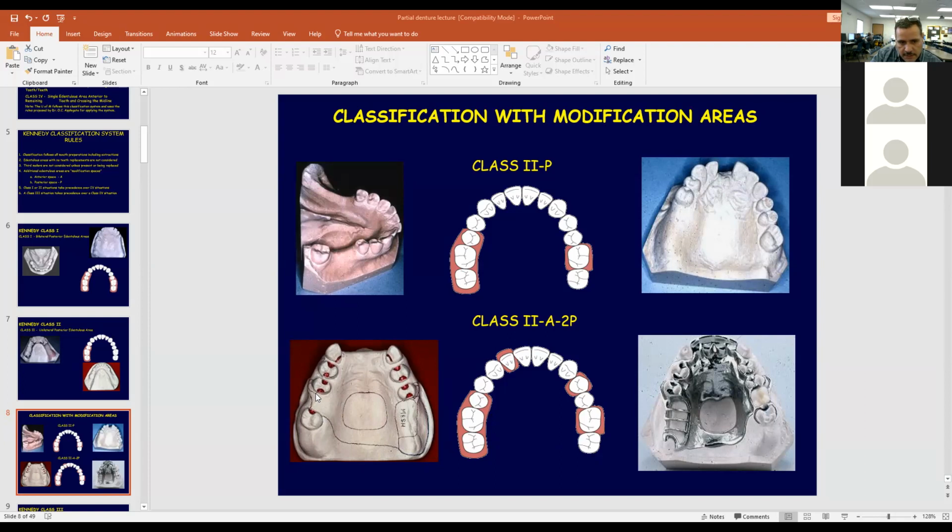You lost this, here's going to be a little bit of denture base. Here's going to be a little denture base. It depends how much space you have. So you make it round, square, whatever. How much space you have. If you lost a lot of space, you have to make it very small, but at least it should be either a mesh or a bar so that the acrylic will be stuck with it.